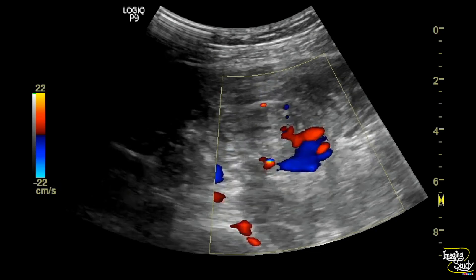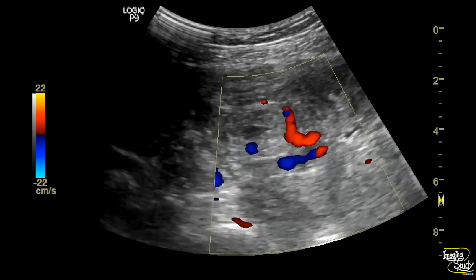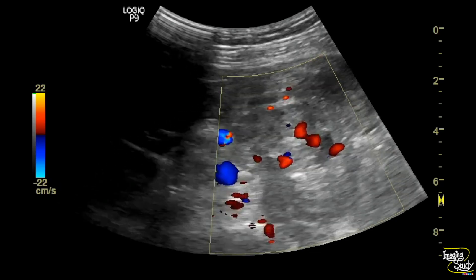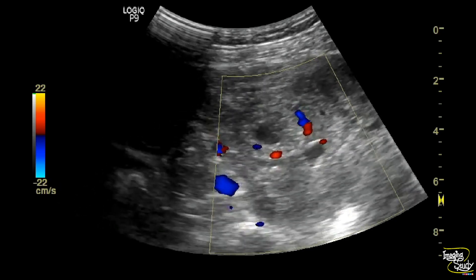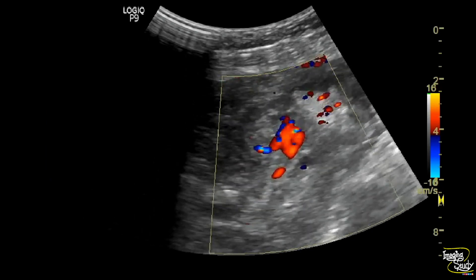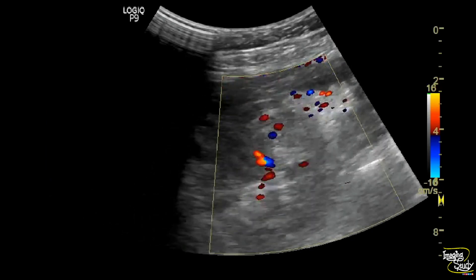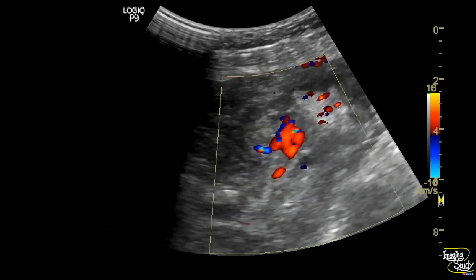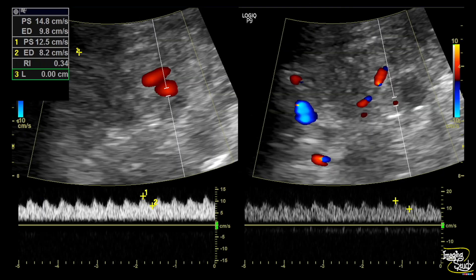To confirm that this lesion is definitely an ectopic pregnancy, you can use pulsed Doppler. We have taken a sample from the adjacent prominent vessels and you can see the flow shows a low-resistant sawtooth-like wave pattern, where the resistive index was measured around 0.34.